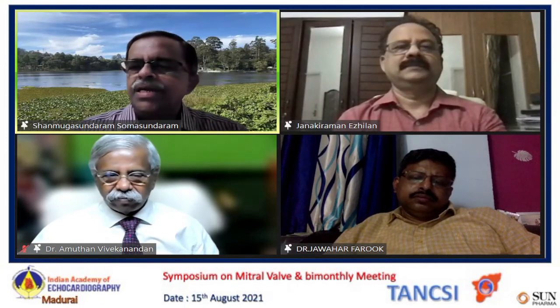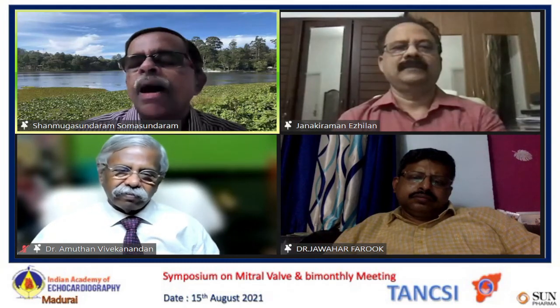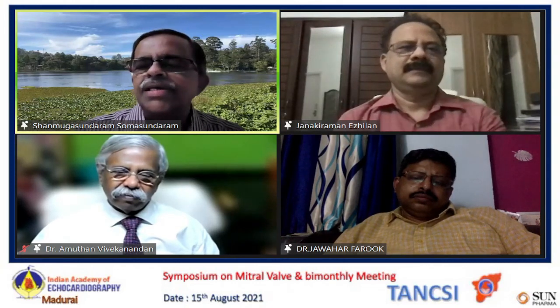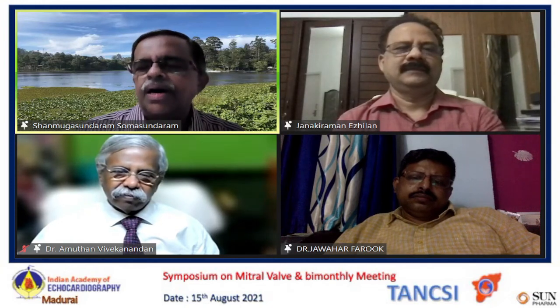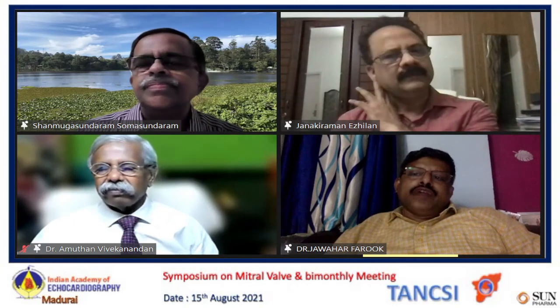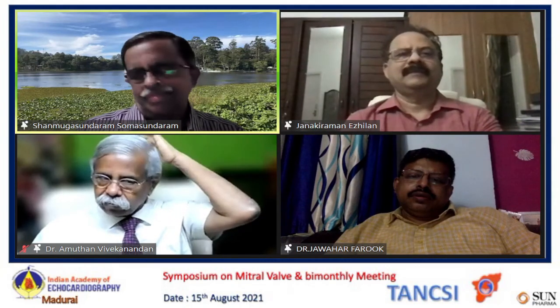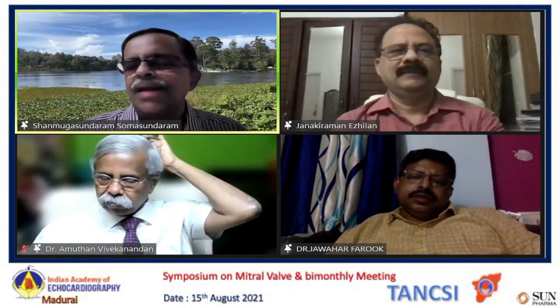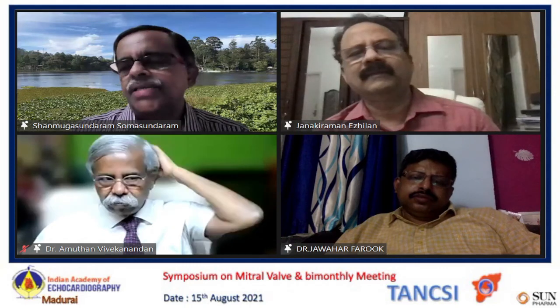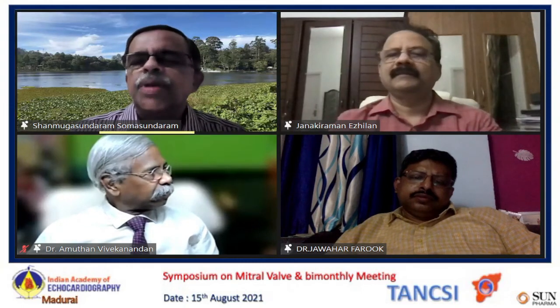I've seen left atrium jutting into the right-sided chest cage in my early days of practice. But whenever you have a very big left atrium, our surgeons used to reduce the left atrial size by excising a part of it. Two of my patients had undergone that procedure. What is the echocardiographic criteria to diagnose giant left atrium, sir? I don't think there are objective criteria. It is only for markedly enlarged, for example, 7 centimeter in any dimension. 5, 6 is quite usual. Anything more than 7, I may call it a giant left atrium.